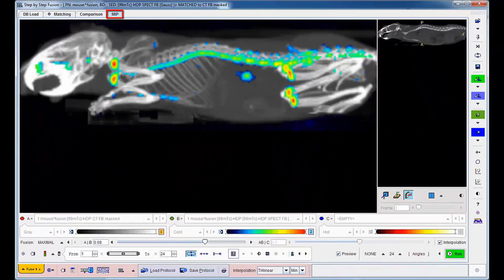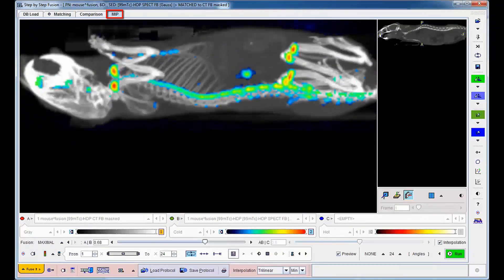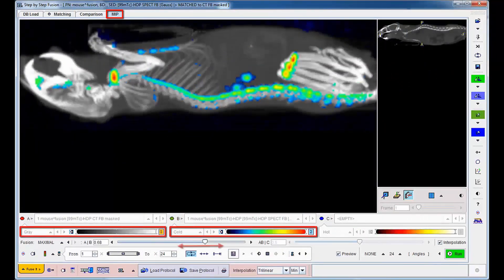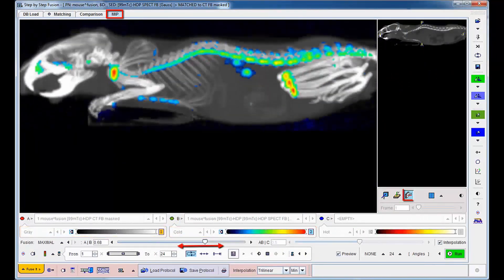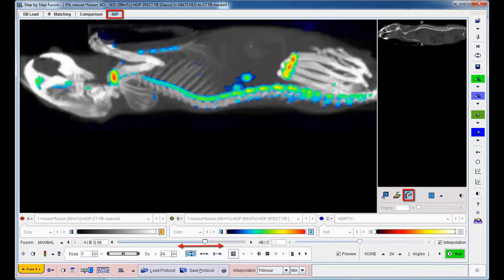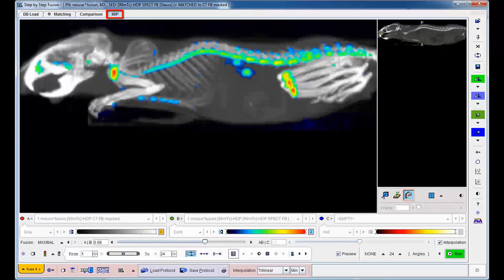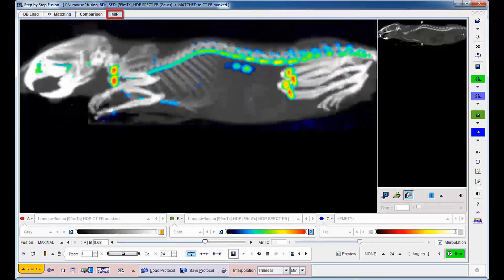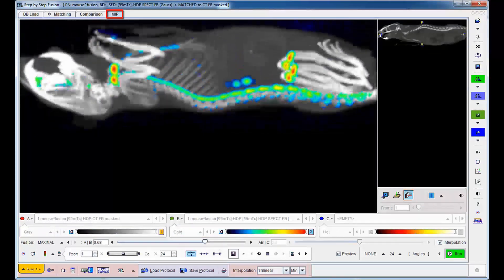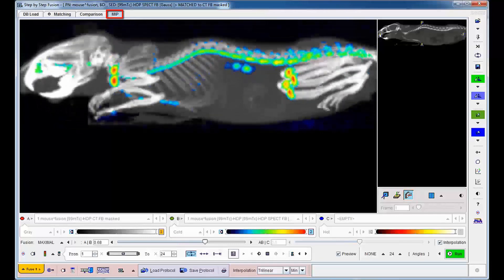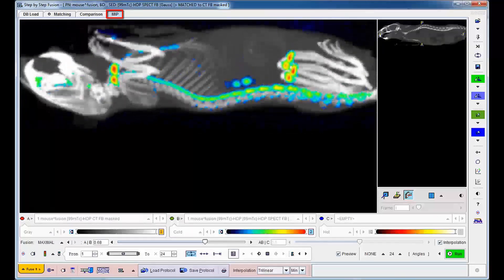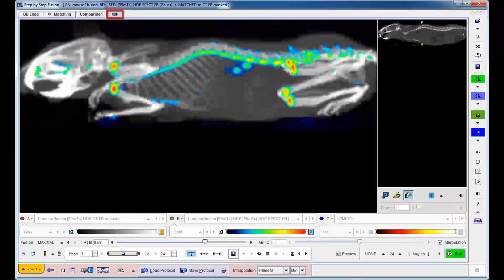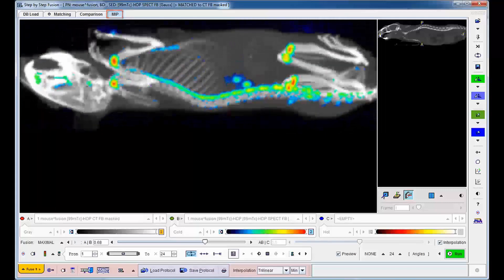After a few preparation steps, such as color table adjustments, fusion balancing and projection tailoring, attractive rotating MIPs are readily generated. They clearly demonstrate the anatomical locations of high-tracer uptake.